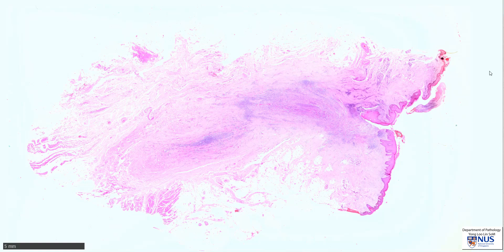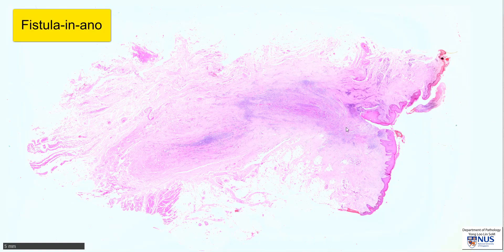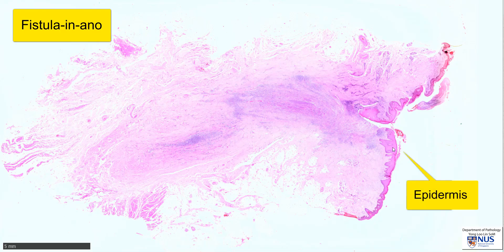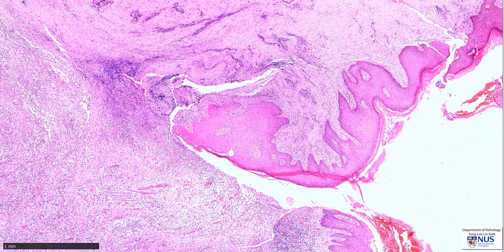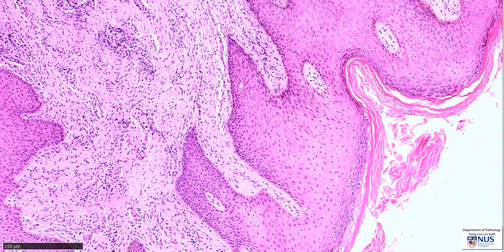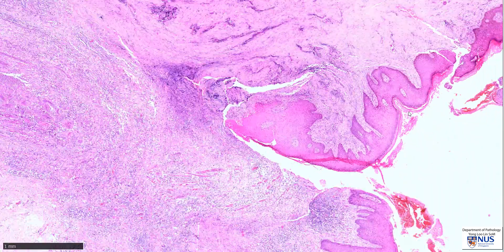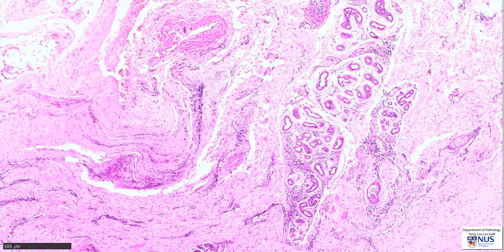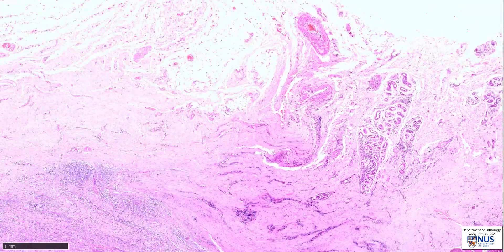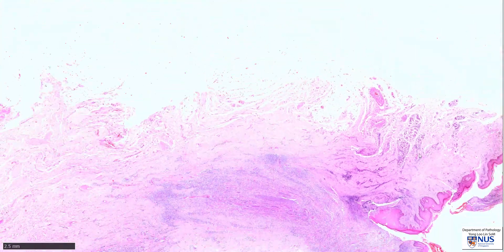Hello, this is a virtual microscopy specimen of a fistula in anal. Here we are looking at the perianal skin with the epidermis, which is composed of stratified squamous epithelium that has surface keratinization. So this is keratinizing stratified squamous epithelium, and there are also some adnexal glands in the underlying soft tissue.